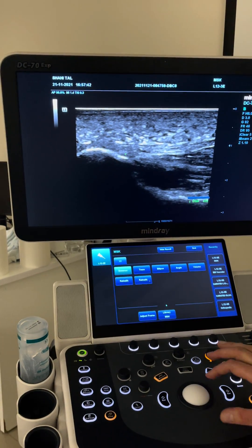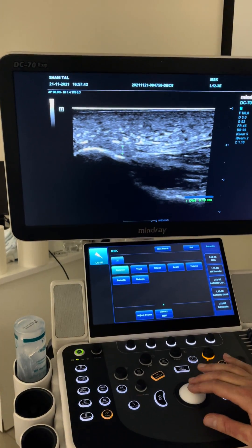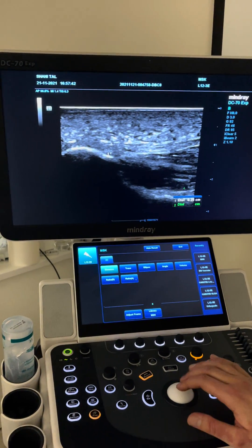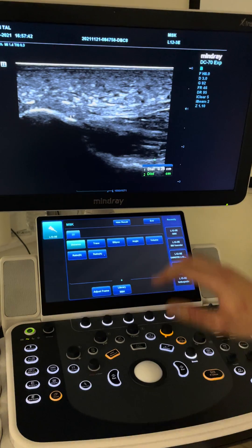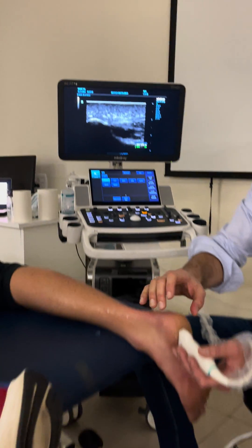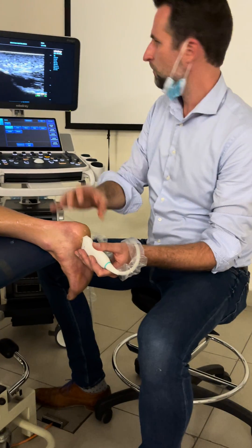You know that when you do your measurement it's going to be around this area. I follow this line and measure — a normal value is somewhere between 0.2 and 0.4. Above 0.4 could be indicating that there is fasciopathy.